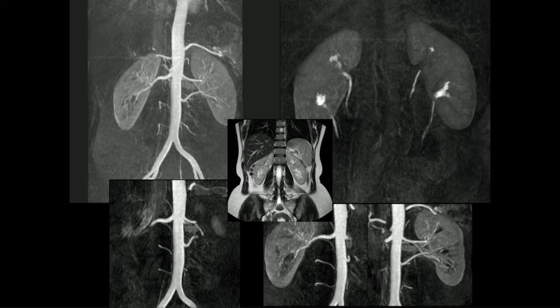And what I hadn't seen on the MR was the fact that this customer had 6 renal veins on the right side. So when they took the kidney out, they ended up with lots of holes in big blue vessels, and lots of patching up needed to be done. The kidney went in the bucket, and the expected recipient, who'd also been put under anaesthetic, had been put under anaesthetic for no reason. So a real disaster all round because we hadn't looked at the veins.